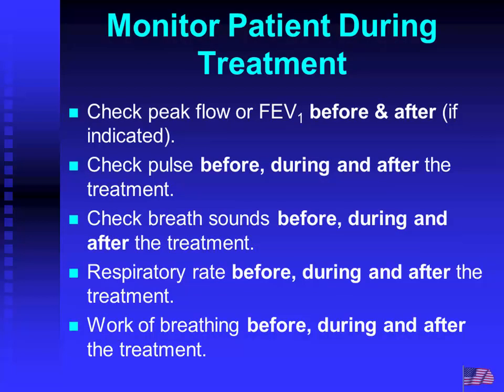Monitor the patient before and after the therapy, certainly using peak flow, and definitely taking a pulse. You want to take a pulse before you start, during the therapy, and after the therapy is done. That, as well as breath sounds, respiratory rates, and assessing the work of breathing. So this is a continuous process. We do our initial assessment, monitor a few minutes into the therapy, and monitor at the end to see if there are any adverse problems happening.